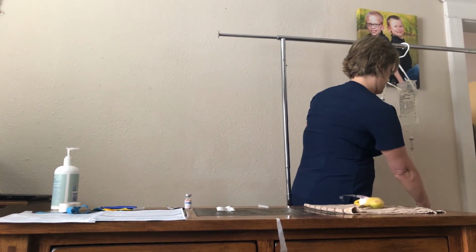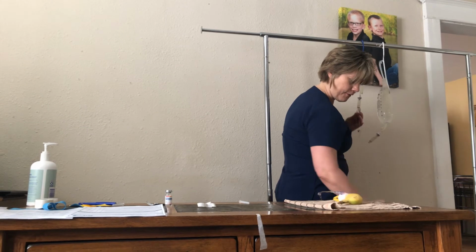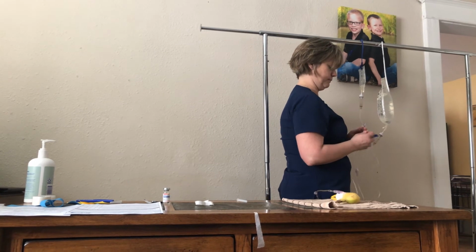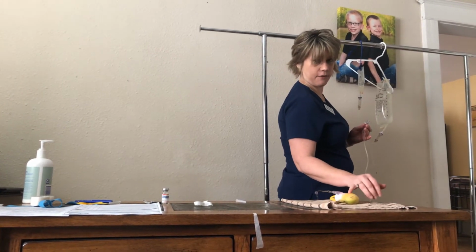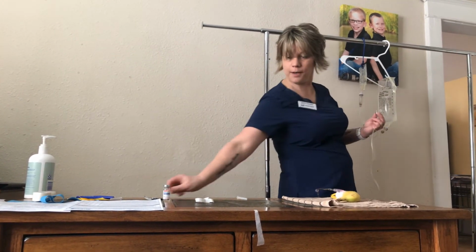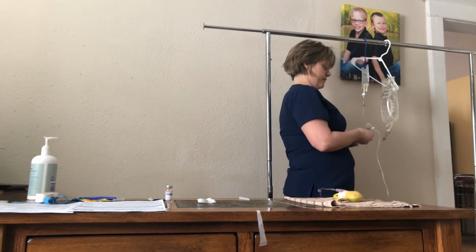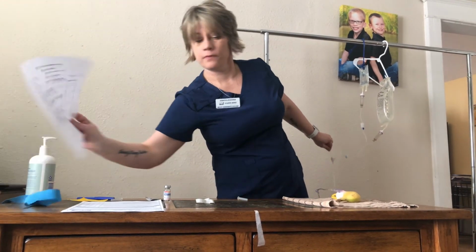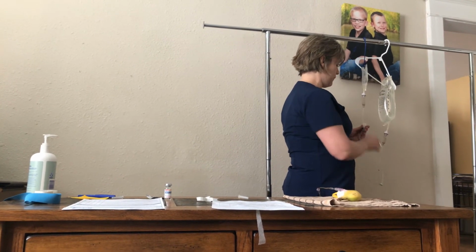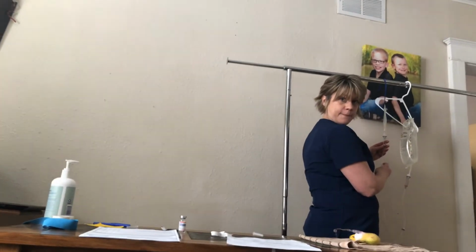Going to use the tubing that's directly above the roller clamp, and I'm going to clamp off my main tubing. Checking on the patient's site, make sure we have no redness, infiltration. I'm going to clean the top of this with my alcohol swab and attach. And again, I'm going to calculate that we're going to have the piggyback be flowing at 12 drops per minute. So at 15 seconds to time it, I will be at 3.